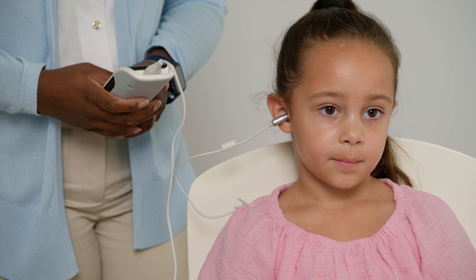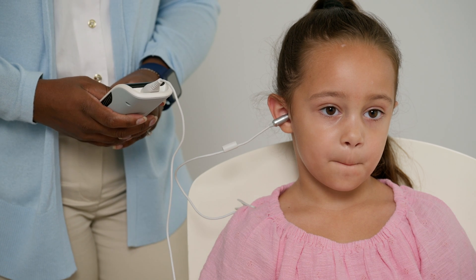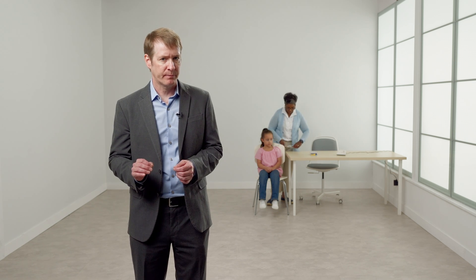During calibration, the patient will hear a series of tones or beeps at different frequencies. The Cordy will adjust the intensity level at each frequency to ensure proper testing levels are achieved in the patient's ear canal. After calibration, OAE testing will begin. When conditions are ideal, the probe check and calibration phase only takes one to two seconds.